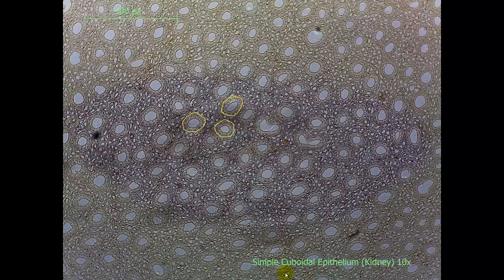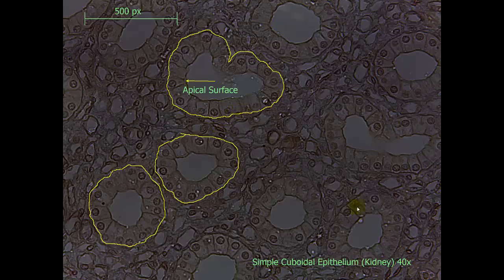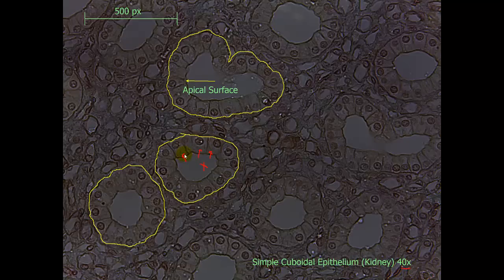Here is a slide showing simple cuboidal epithelium from the kidney with the low power, or 10x objective. They are shown by the circles. We can see the lumen on the inside, and we can see the clearly defined cube-shaped cells within each. Here is a 40x objective view of the same tissue in the kidney. Here is the lumen indicated by the X, and here are your simple cuboidal epithelial cells. We can clearly see each of the plasma membranes between the cells.